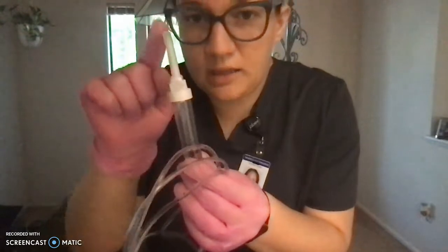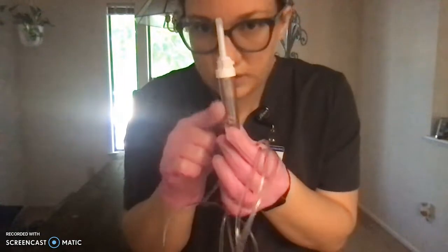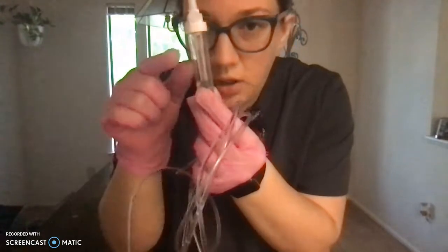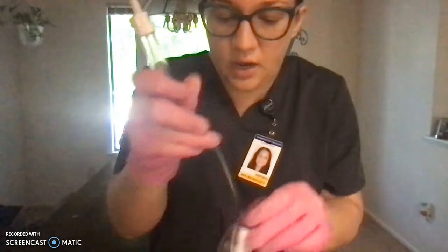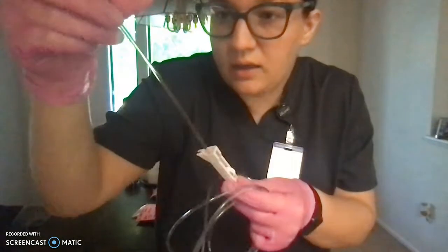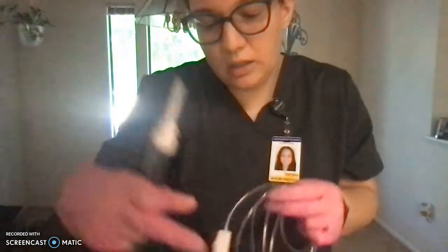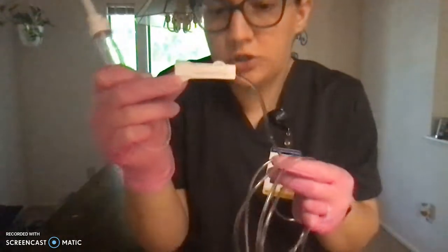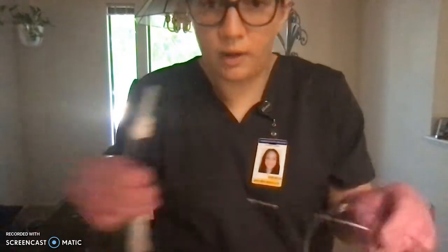Then I'm going to go over the actual IV tubing with you. So this is the spiked end. It is a sterile end, so we want to keep that sterile until we spike the bag. And then this is the drop chamber. This is where we're going to count our drops for at least 1 minute. And as we move down, this is the tubing. It's super important that once we spike the bag, we get any air bubbles out of the tubing. This is the roller clamp. The roller clamp is currently off, just for when we spike the bag, and then we'll turn it on and we'll prime our tubing.